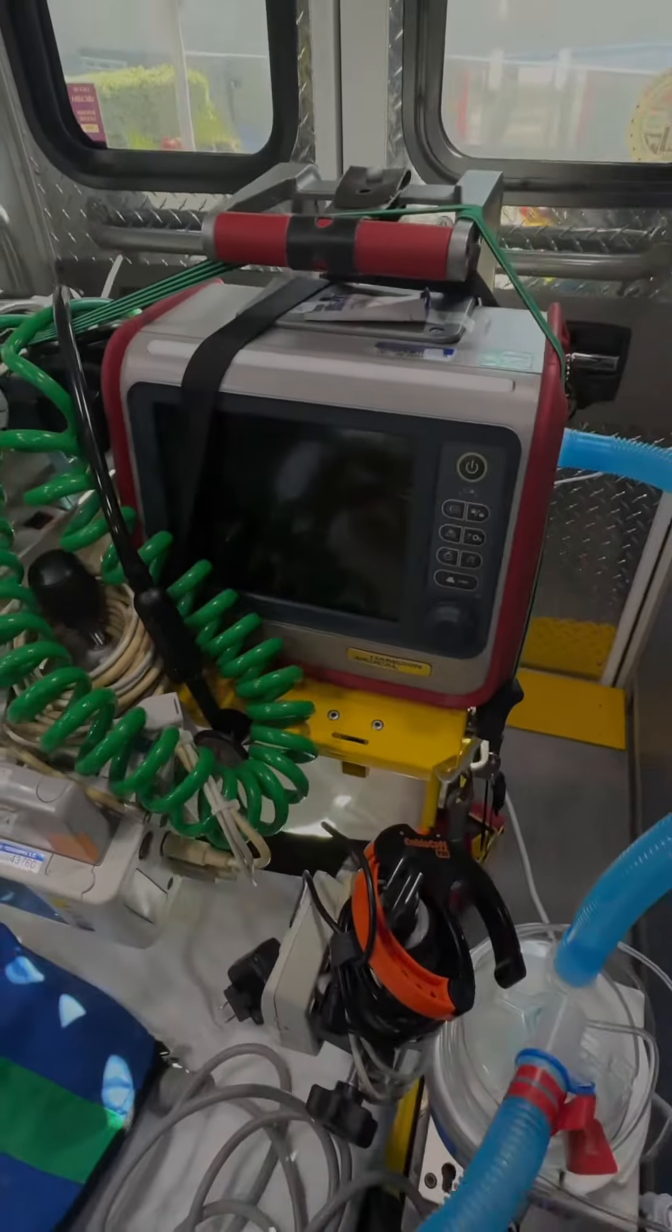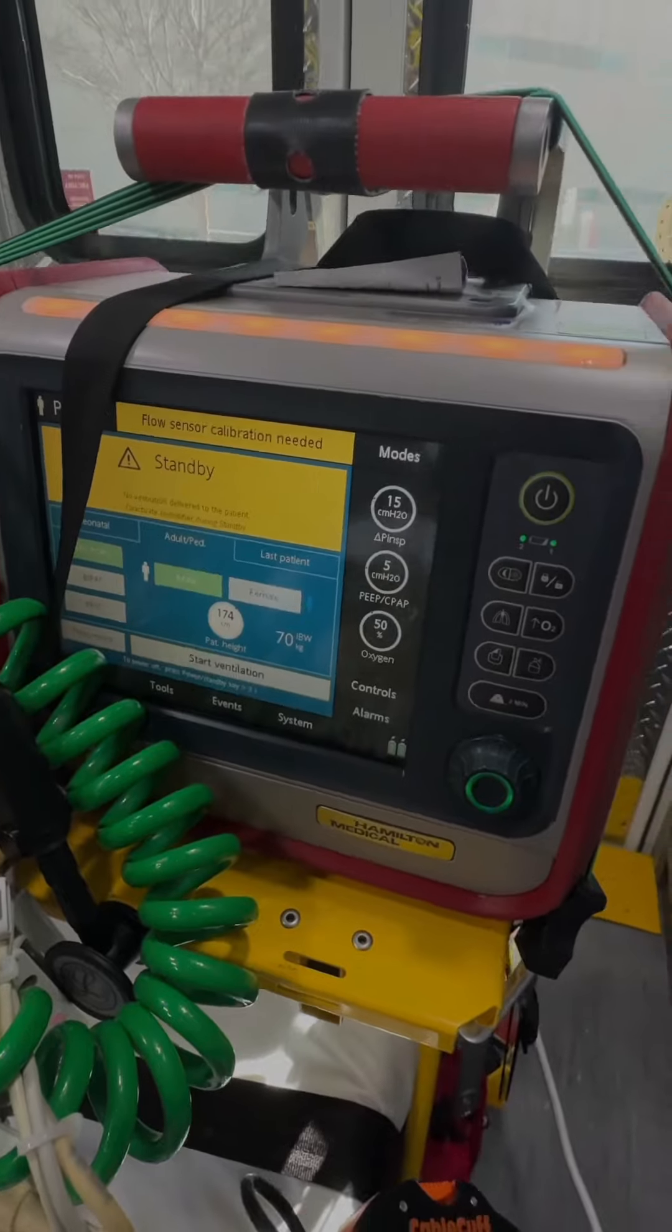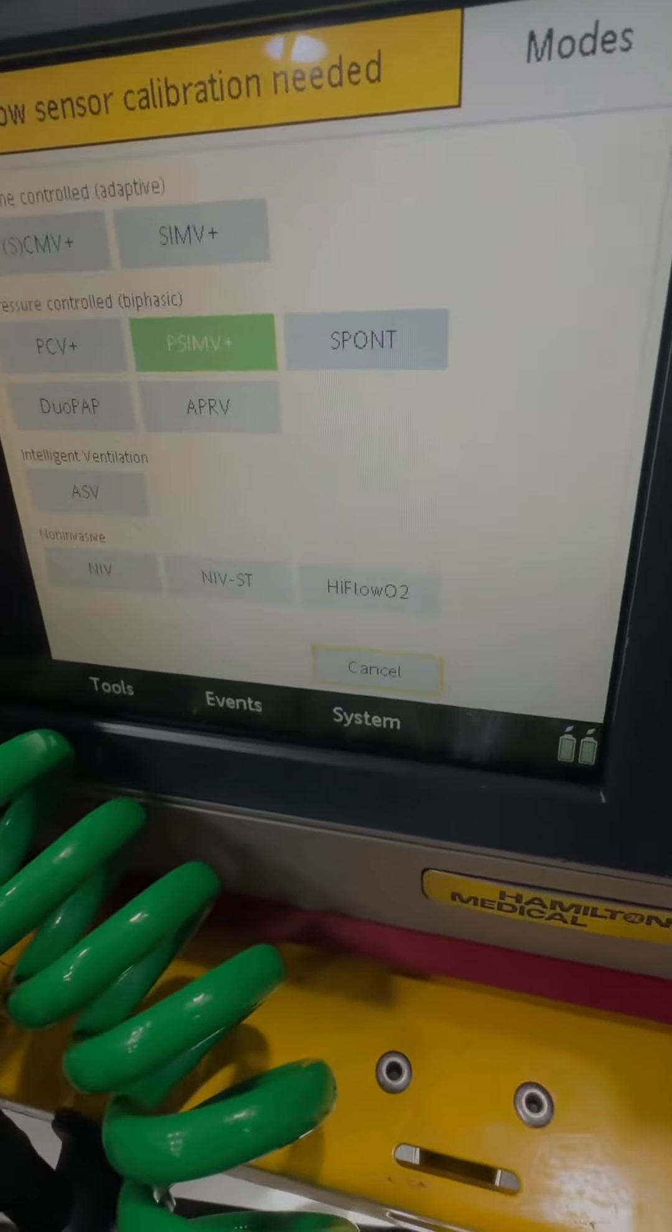Let's go ahead and turn this on here. After turning on, you'll go over to modes and then you will hit high flow.